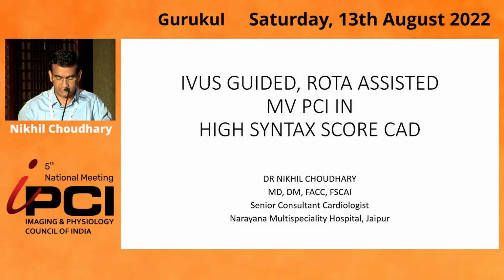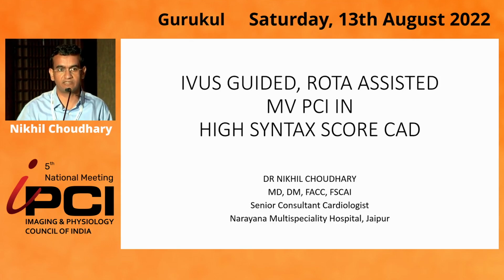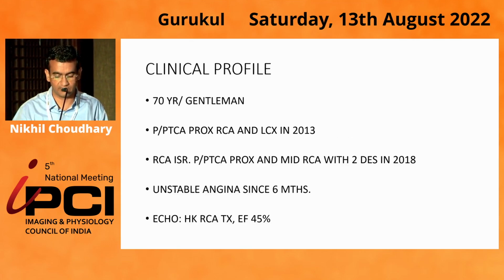I'm Dr. Nikhil Choudhary from Jaipur. I'm presenting a case of IVUS guided rota-assisted multivessel PCI in a patient with high syntax score CAD.